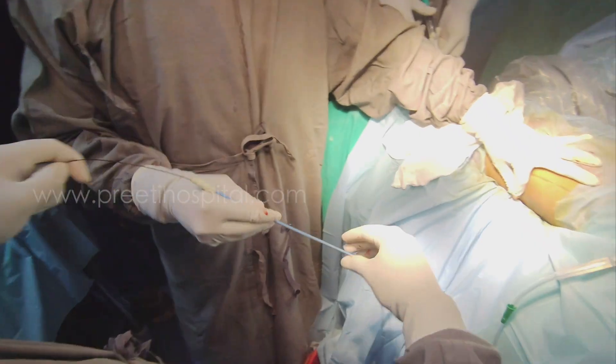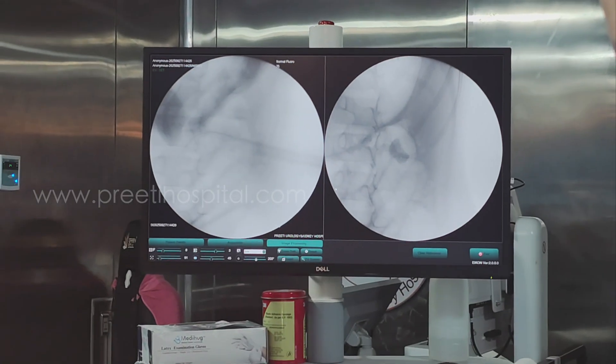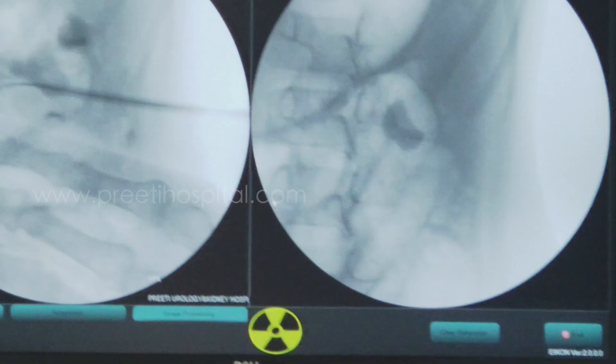If you do free-hand dilatation, it is not good — it is moving too much. This is very dangerous. Then put the hand as counter pressure. I was continuously pressing. With experience I am going, but this is very dangerous. I adjusted and am now in a better position.